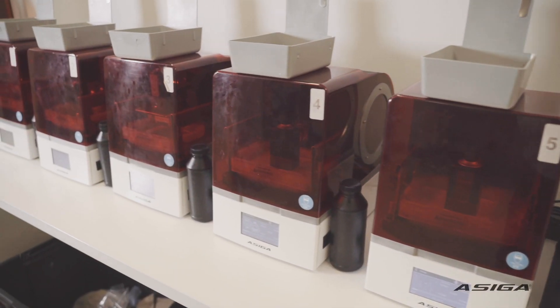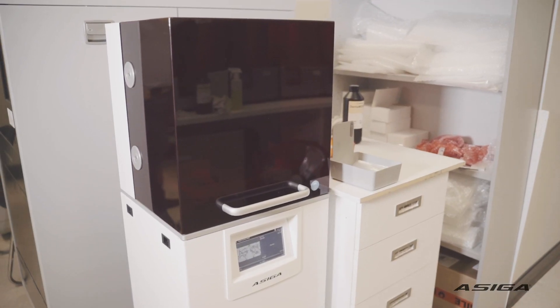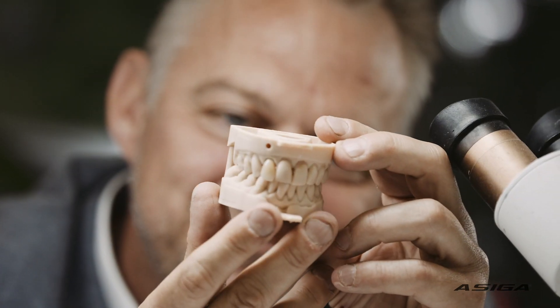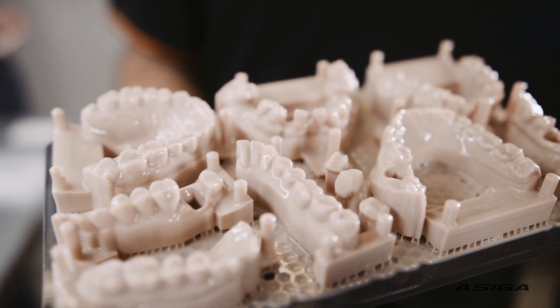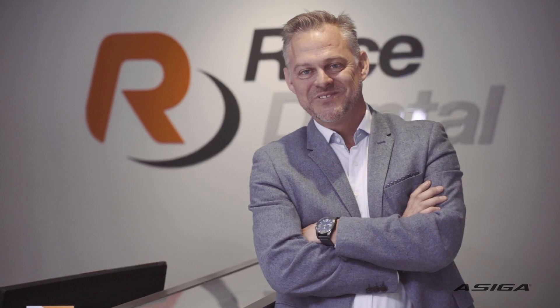We've been running the Max UV for some time now, but we've just taken on their Pro 4K. It's got a larger platform and faster results. I was surprised to see it's an Australian-made product. Their technical support is awesome, although we don't see a lot of it because they're reliable machines. We've got maybe 15 to 16 across Australia, New Zealand and Singapore, and we're planning on taking on more.